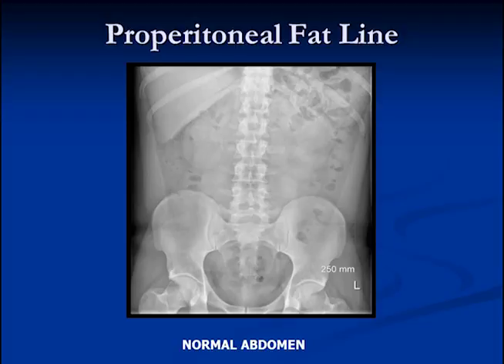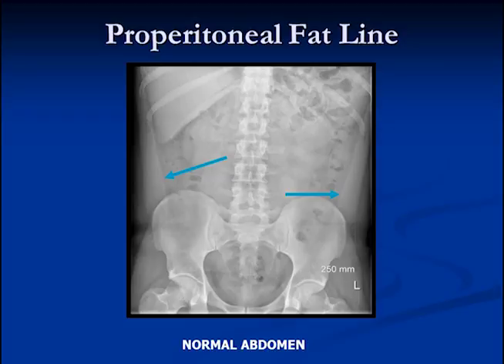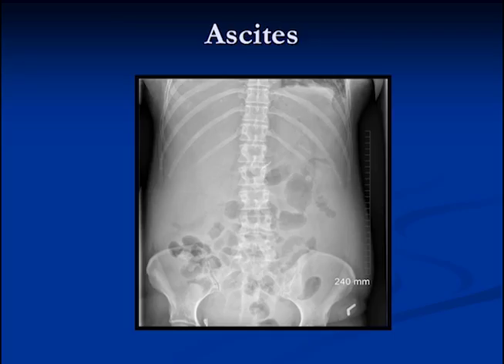We're going to talk about another line that we can see called the properitoneal fat line. On this normal supine view of the abdomen, you can see the kidneys and the edge of the liver. If you look closely, you can see an interface between dark and white on either side — this is called the properitoneal fat line. On the outside is soft tissue of the abdominal wall; on the inside is fat in the peritoneum. Immediately next to this line is bowel — you can see large bowel with little fecal material immediately adjacent to the properitoneal fat lines on both sides.